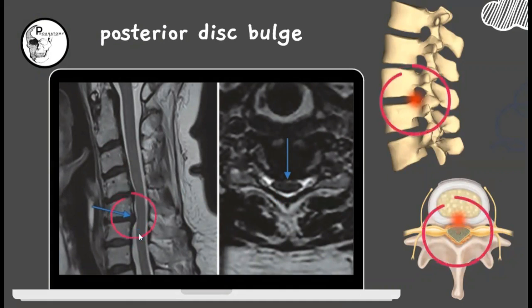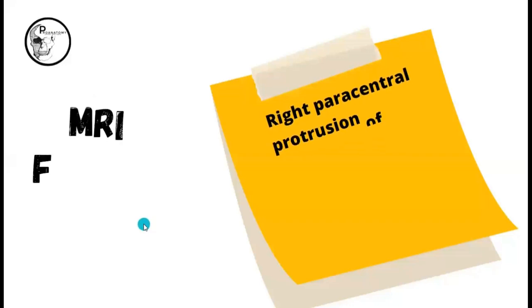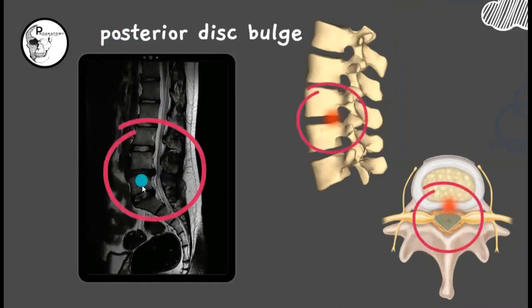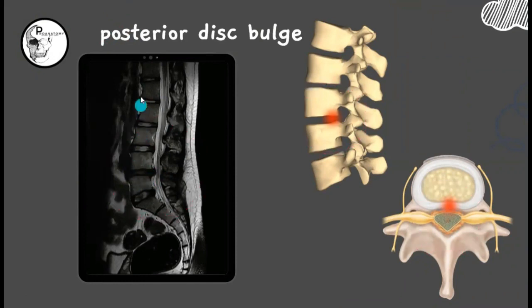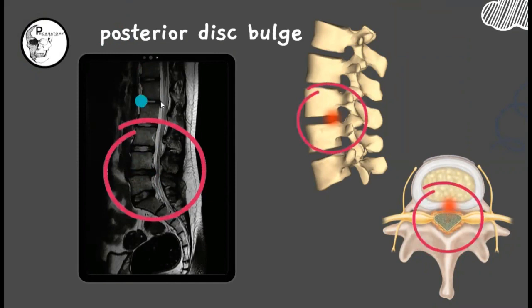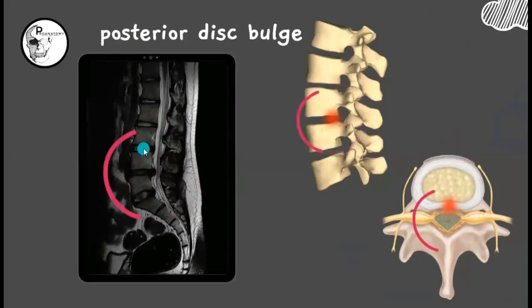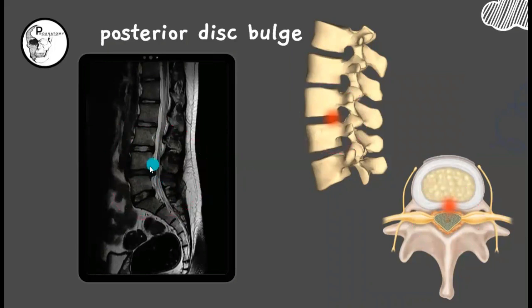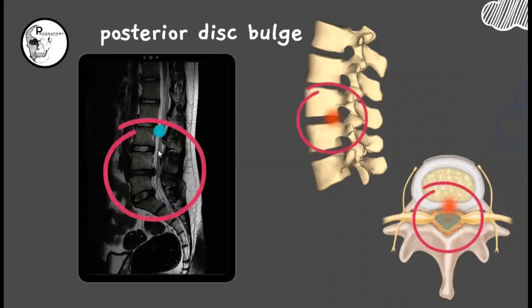These findings create associated signs and symptoms. Here is the sagittal section of the lumbar region where you can clearly make out a posterior disc bulge. Comparing with the other discs, at the last two levels you can see the posterior part of the disc is projecting backwards, causing thecal sac indentation and a small stenosis of the spinal canal through which the spinal cord passes. This is an example at the level of the lumbar vertebrae.